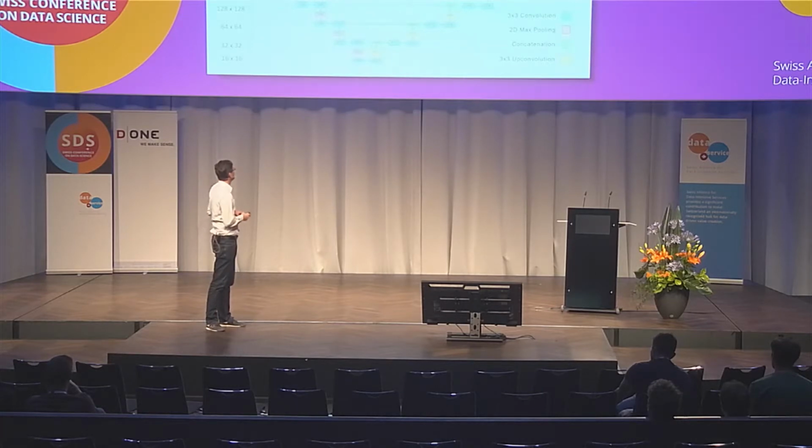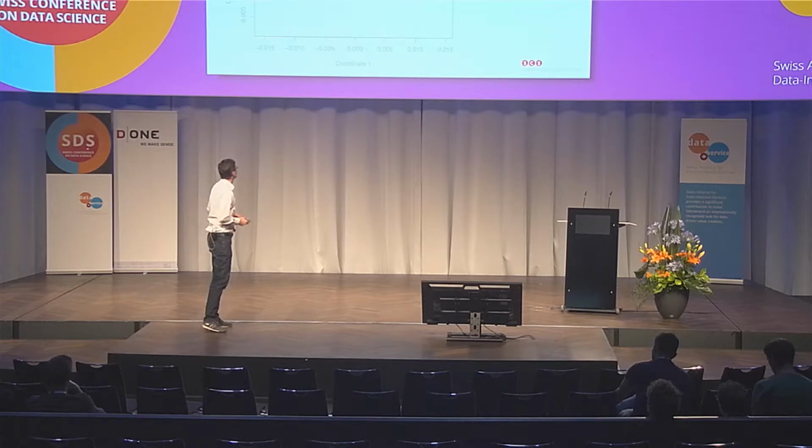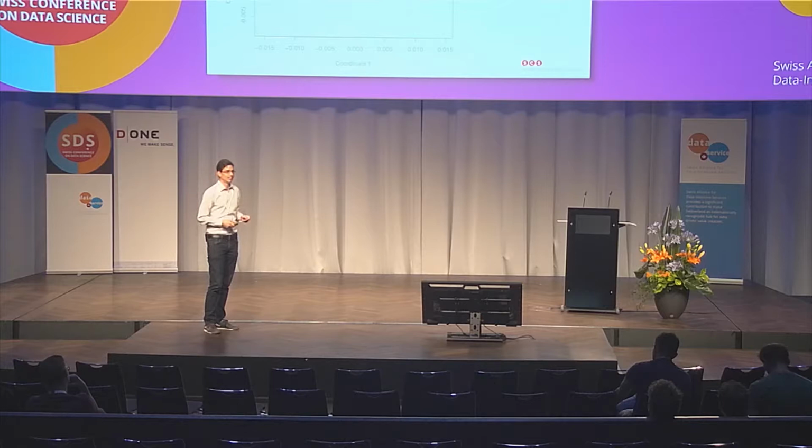Good. Now, I would like to talk to you about the performance of this UNet, of the CNN. So we evaluated the predictive performance of the CNN on the test set, and the results you can see here. This plot is called the multidimensional scaling plot. It's basically similar to PCA, to principal component analysis. Let me tell you what you see here on this plot. So what you see here in blue color are actually the predictions of our CNN algorithm. And in red, in those red squares, you can see the ground truth labels of the test set.